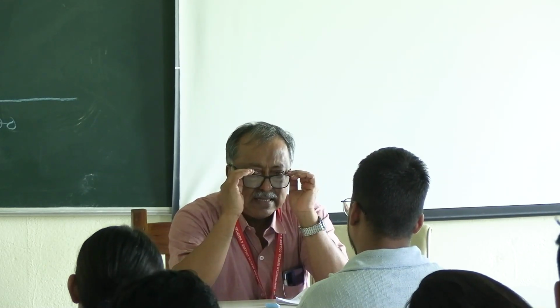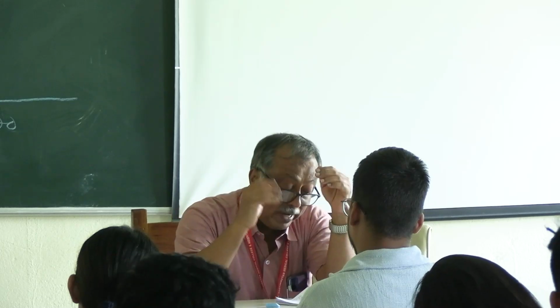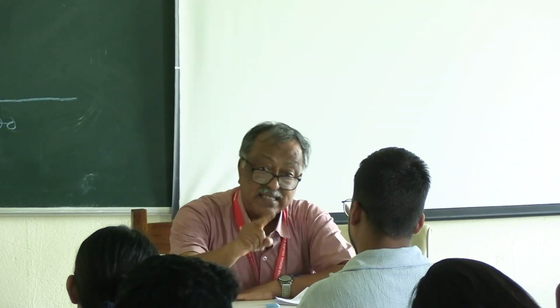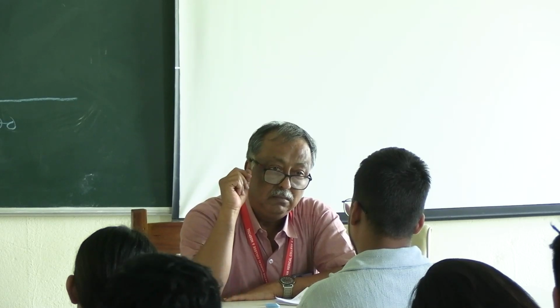And when we examine the stapedial reflex, we always give 70 to 100 decibel sensational level.